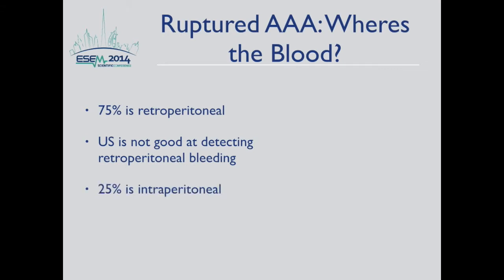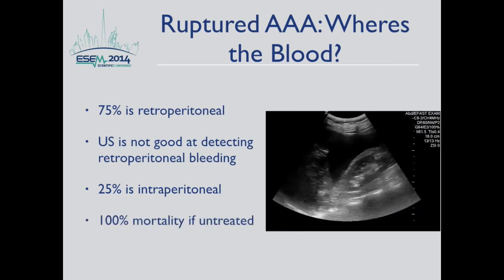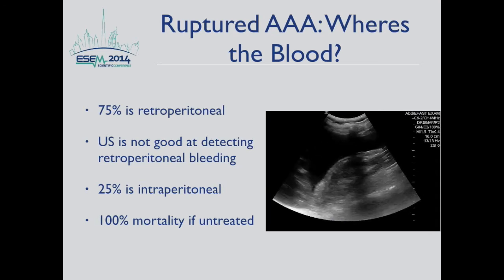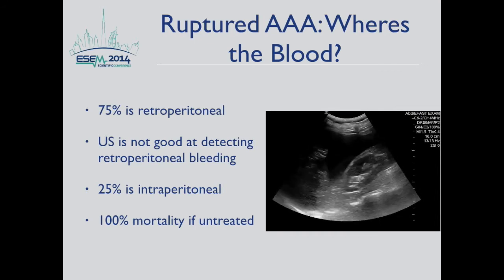An abdominal aortic aneurysm occasionally ruptures in the intraperitoneal area, with free fluid rapidly identified by ultrasound. In this case, you can see this is actually a patient who came in with a PEA arrest, and the patient had a history of an abdominal aortic aneurysm that was not repaired.